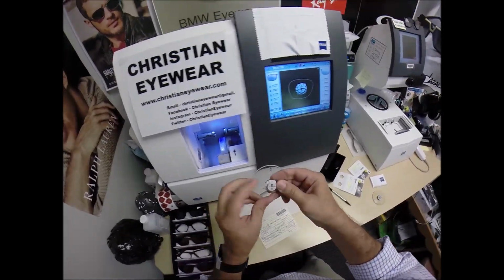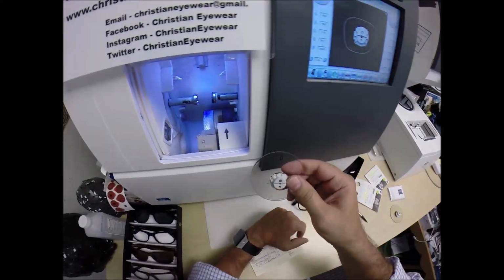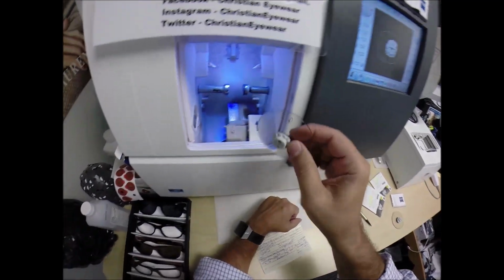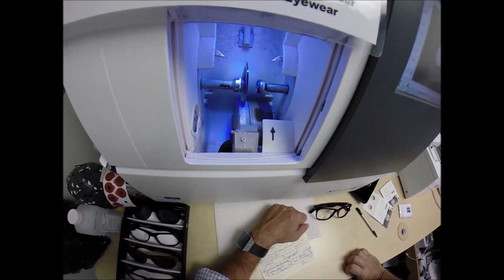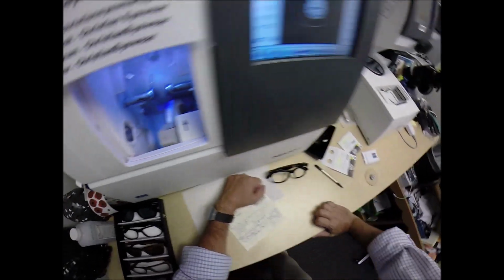Press the sticker on there firmly. Now the magnet's going to do its job a second time. It's going to attach itself to another magnet there in the chuck, or as I like to call it, the Charles, because I just don't know this machine well enough to call it Chuck.